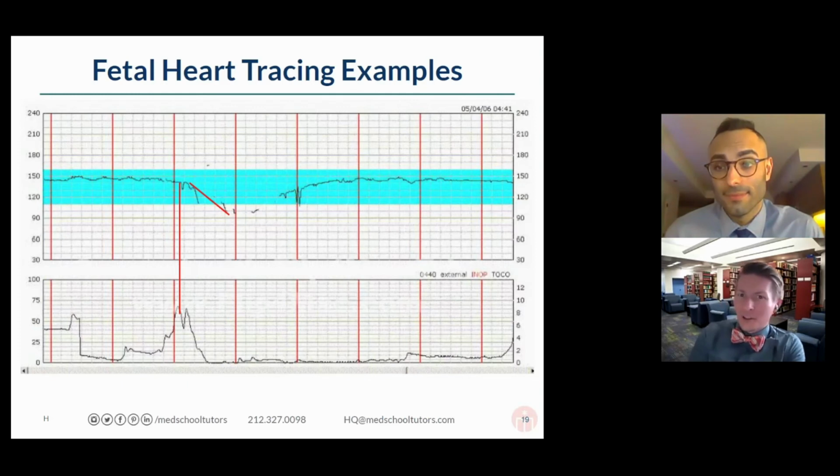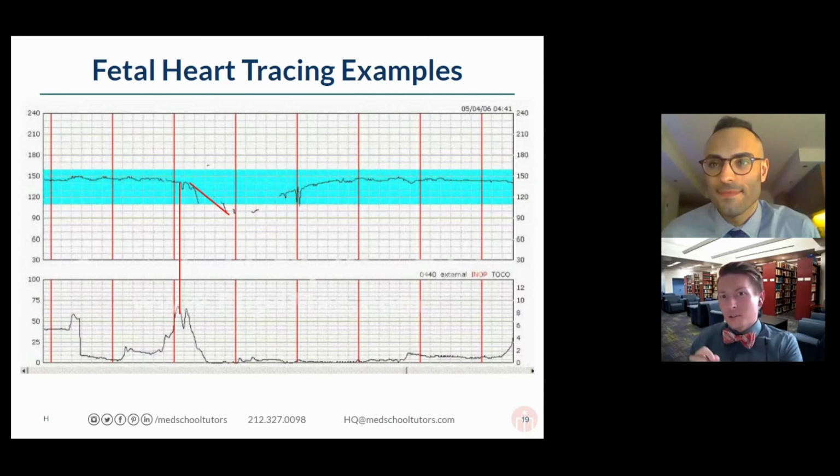And if she's coming into your clinic for an antenatal checkup, she's probably not experiencing regular contractions to allow you to see that. Now, the contraction stress test is a little bit dangerous because if you give oxytocin to a woman who's at 33 weeks, I wouldn't be surprised to see that she goes into labor at that point. And so we don't like to do that test anymore, and we've replaced it with biophysical profile. But when you see contraction stress test as an answer on the exam, it's very unlikely to be the correct answer, but it's in there for UWorld and for the shelf exams and for Step 2 CK. That was historically the thing that we would do following the non-stress test.